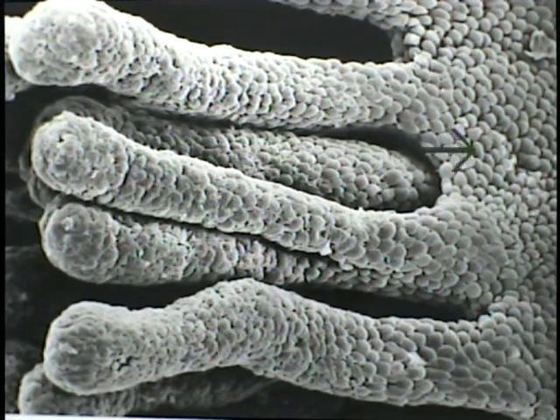So the intestinal floor, that region in the direction of the villi, will be in the direction of the arrow, and the floor here, the villi growing out from that floor, and in between the villi, as you'll recall, grow down the intestinal glands, these simple tubular glands. This is a view, after the other tissue, the lamina propria, has been digested away, simply dramatically illustrating that these crypts of Lieberkuhn are simple tubular glands. And this is a view from their external surface.